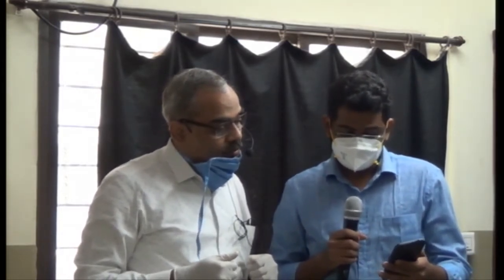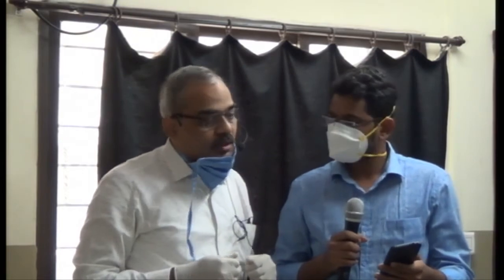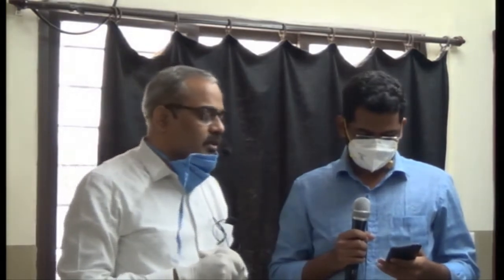Phasicity of portal vein is due to respiratory variations. Yes, respiratory variation, as well as some cardiac factors are also important, and they also result in respiratory variation in the portal vein.